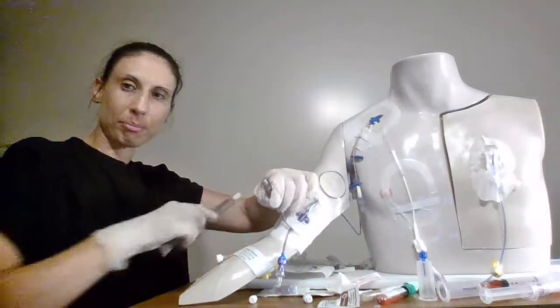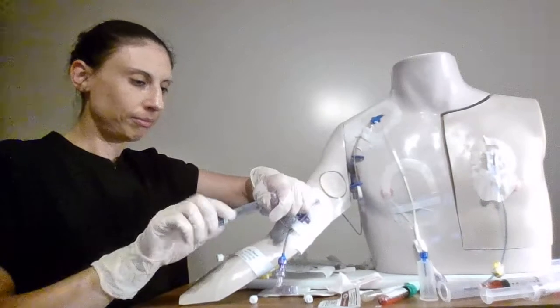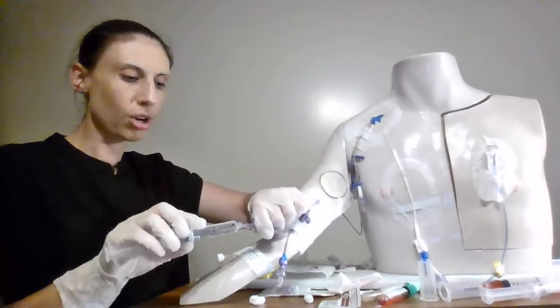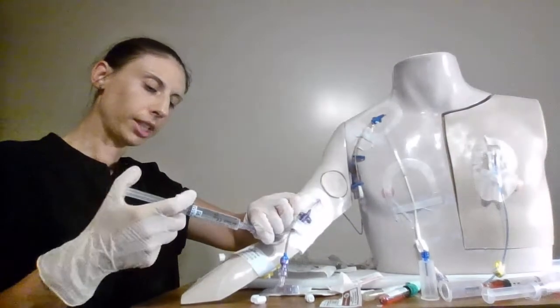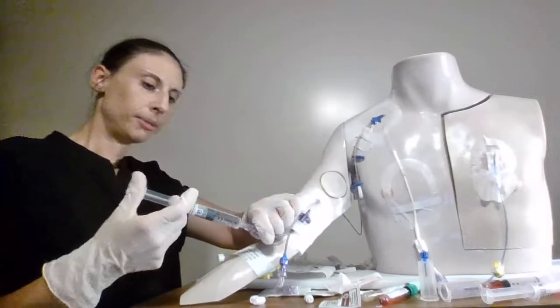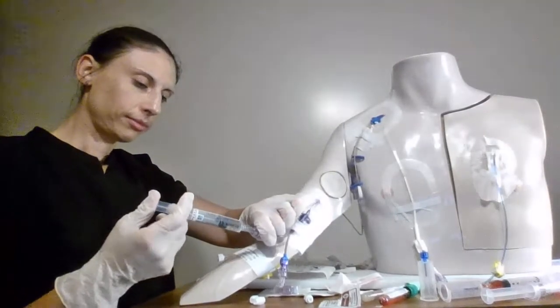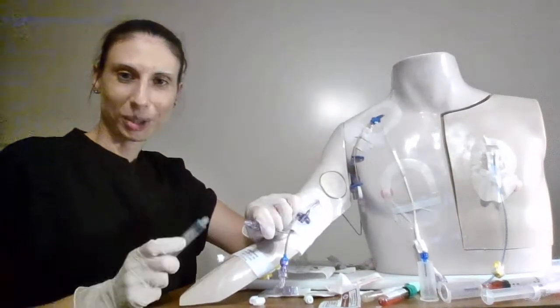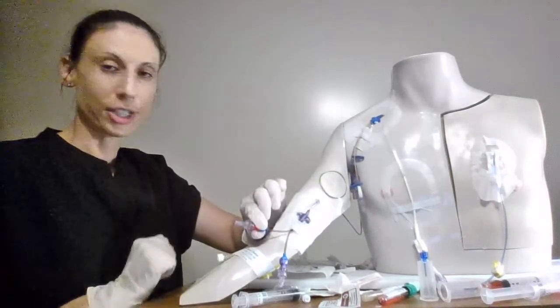We're going to do that again because remember blood is sticky. We're going to try to get all that blood out. Always after a blood draw it's 20 cc's. Again push pause, push pause, nice turbulent flow. And that's all we need. Our line is normal saline locked.